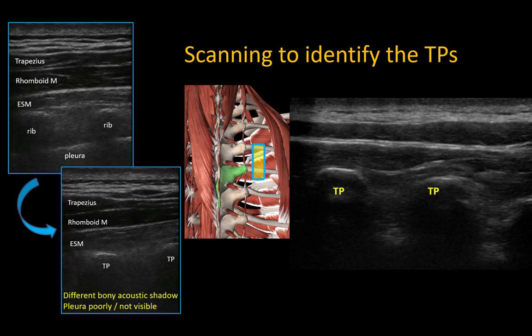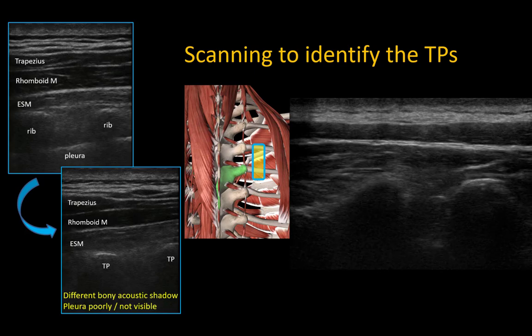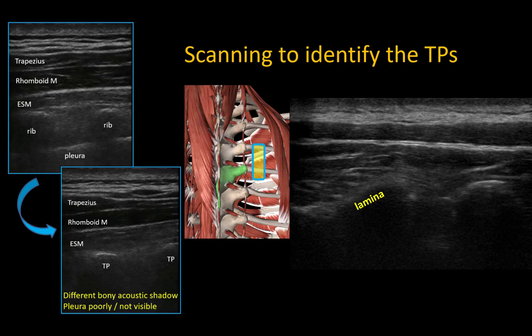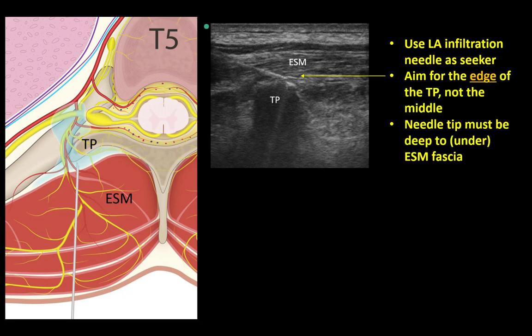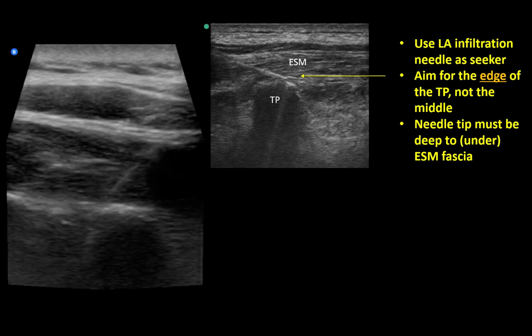If the beam is directed more medially, the bony contour will change from squared-off transverse processes to a flatter profile of the lamina. Noticing these details will help orientate you when manipulating the probe to achieve in-plane needle-beam alignment. I recommend using a longer needle to infiltrate skin and muscle with local anesthetic and then use it as a seeker needle to better plan your trajectory and needle-beam alignment. Advance the needle aiming to land towards the edge of the transverse process rather than the middle of it, which allows advancement of the tip slightly deeper beyond the fascial layer if necessary. It is critical that the tip be placed deep or anterior to the investing fascia of the erector spinae muscle.